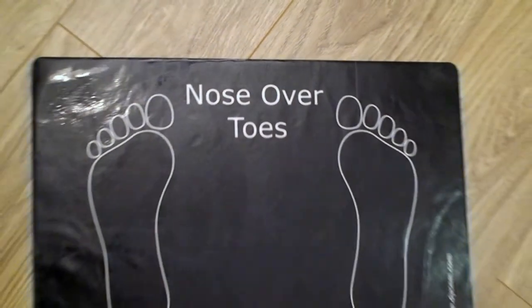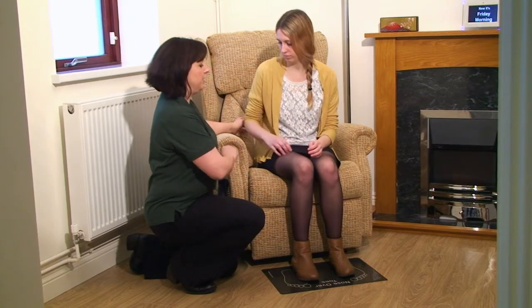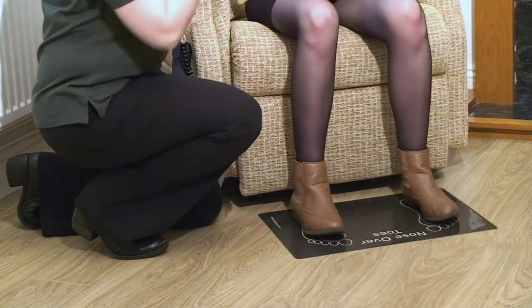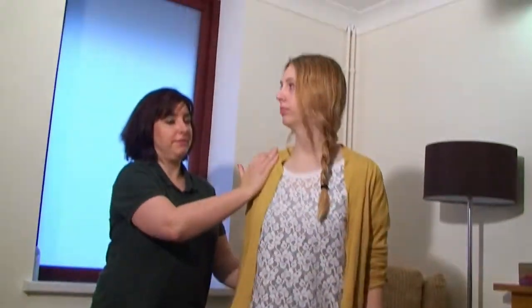DICEM's nose over toes mat can be placed on the floor by a bed, chair, or toilet, and is used to help people to get from sit to stand or stand to sit. It was developed by an occupational therapist and was trialled in both the community and the hospital.